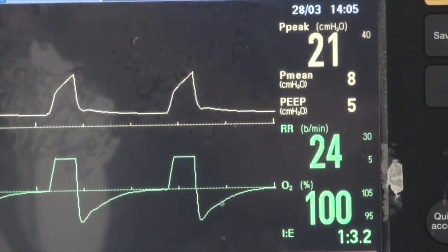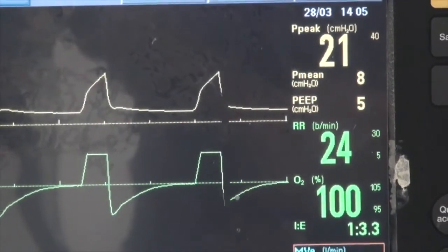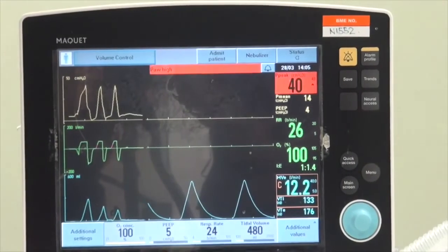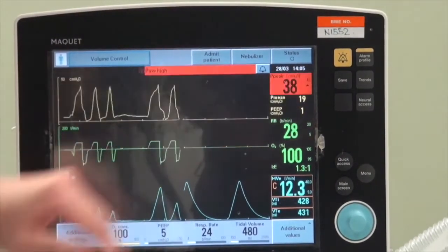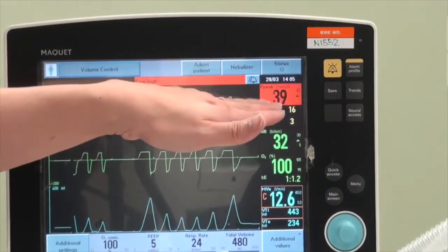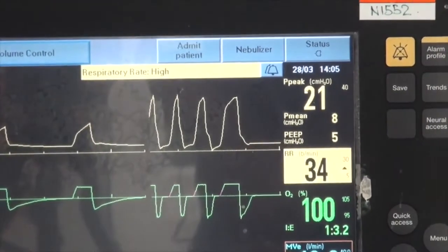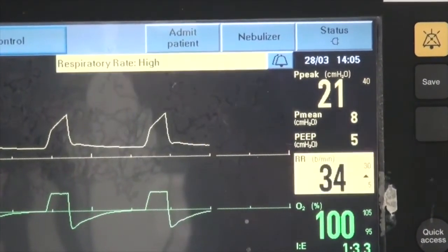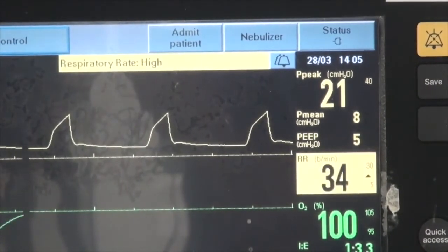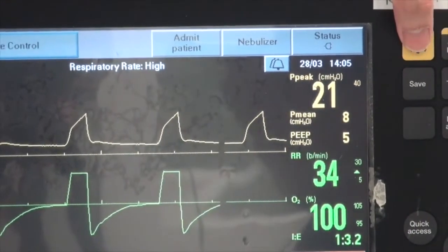Let's demonstrate an alarm message. You can hear the alarm — what is reflected here is that the peak airway pressure is very high, reflected by a blinking red light as well as a message indicating the problem. When this happens, go back to the patient, examine the patient and circuit, then correct it on the ventilator. To silence the alarm, press the top right-hand button.